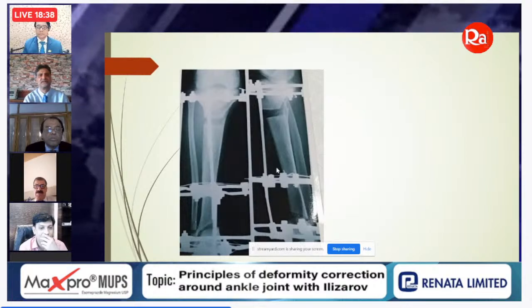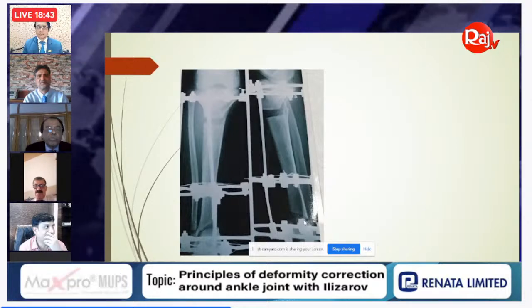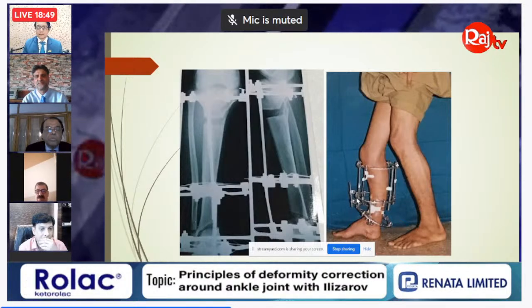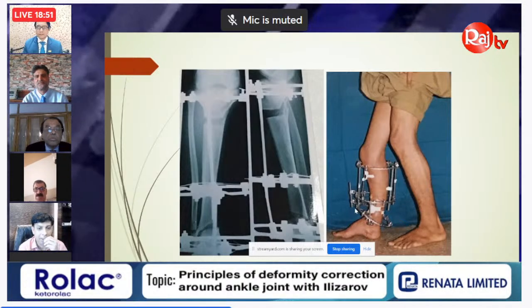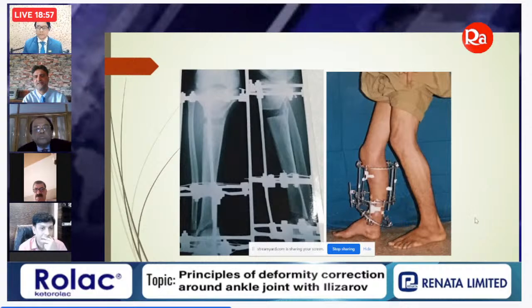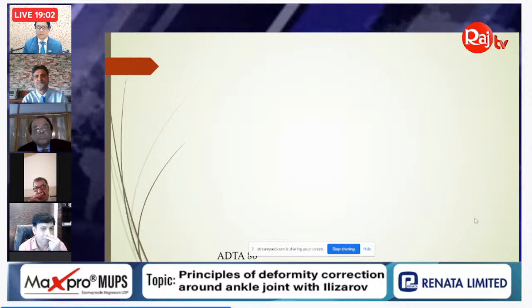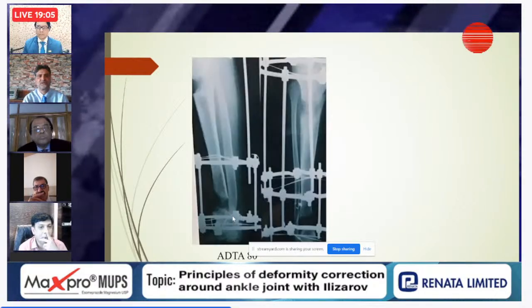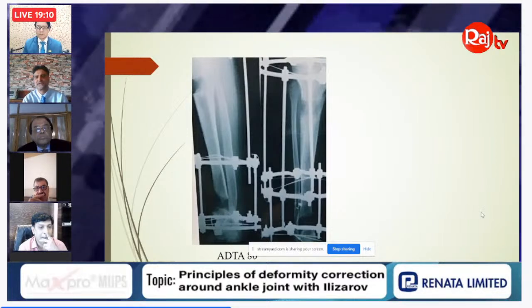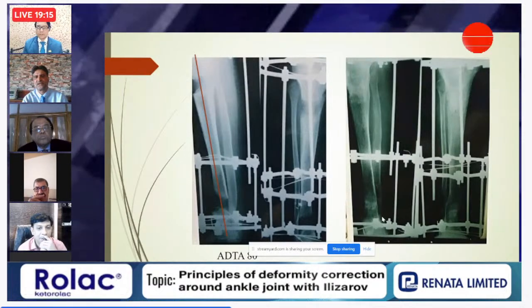Since this child needed simultaneous lengthening, a proximal corticotomy was added while deformity correction was performed distally. The frame shows the amount of recurvatum with distraction hinges distally. During correction, the distal fragment rotates inside for compensatory translation, and the final correction restored the ankle joint to its proper position.